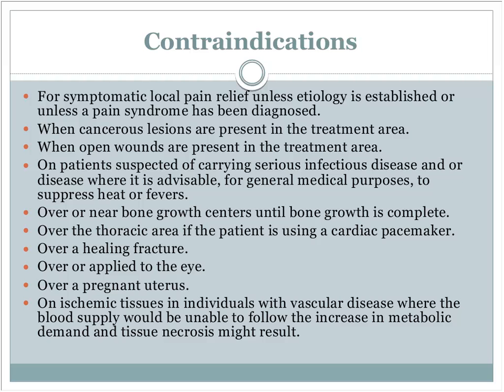We don't do it over the chest when they have a pacemaker because, just like a microwave or a diathermy, you can actually affect the pacemaker or create enough heat to damage the pacemaker or the surrounding tissue. Certainly not over the eye. You know, some of these are really obvious. I wouldn't do it over a pregnant uterus. I don't see any reason to do that.